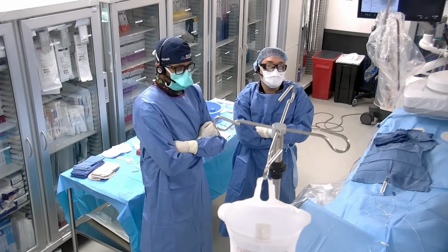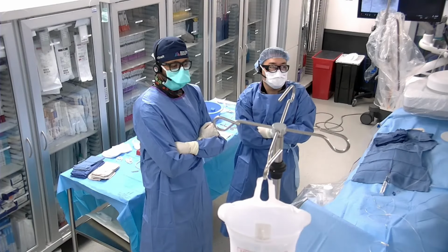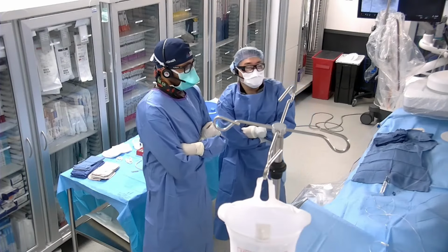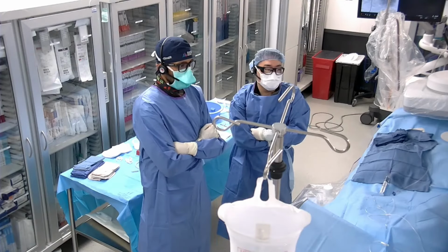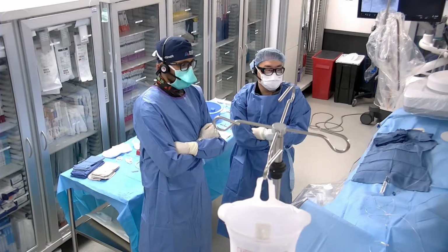And so she wanted to go ahead and embolize this. Her proximal splenic artery is about 7.5 millimeters in size. And so, this is well over 2.5 times size of the vessel, just proximal to it.